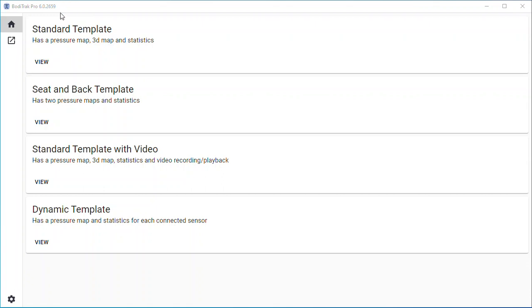You can see at the top there's a version listed, and you will be receiving software on a flash drive, which you can then insert in your computer and then download. If there is a more recent version, if that computer is connected to the internet, it will reach out and try to pull that down as well. If you're in an environment where the IT controls downloads and controls flash drives, you may need to go to them and ask for permission to download via link, and we can provide a link to do that.